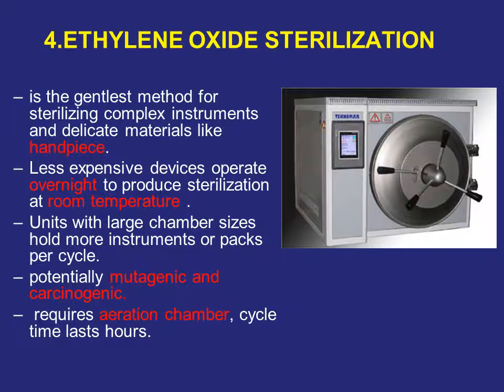Ethylene oxide sterilization. It is the gentlest method for sterilizing complex instruments and delicate materials like handpieces. Also, it's less expensive. Sterilization is at room temperature, but overnight. The device operates overnight. Units with large chamber sizes hold more instruments or packs per cycle.